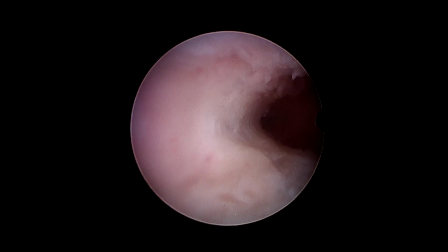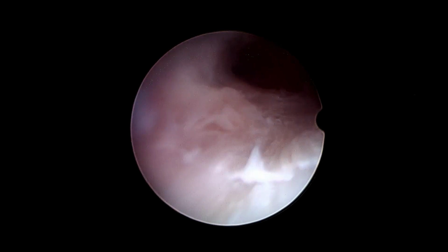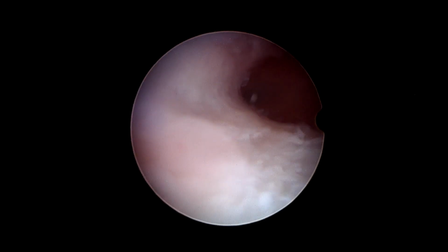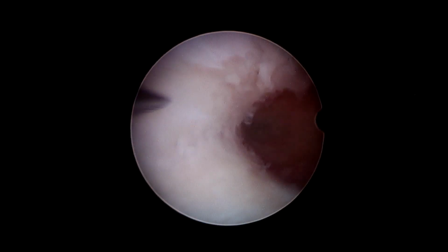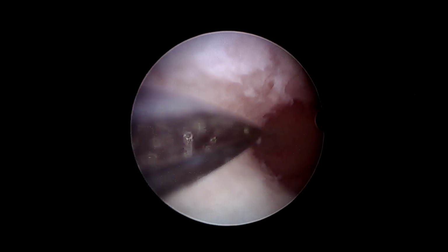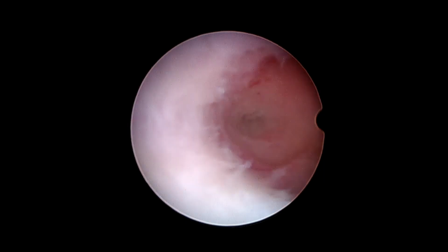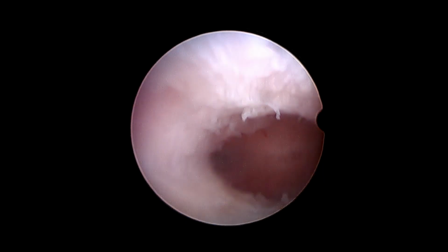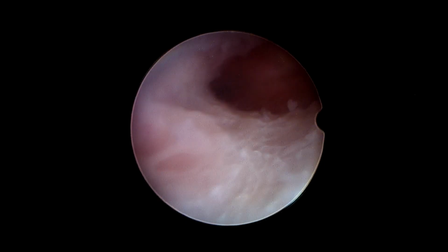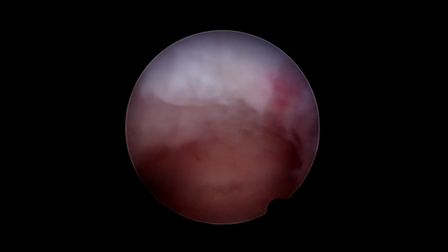This is the ostium of the right fallopian tube. Here also you can see a good amount of endometrium, and here you can notice the anterior and posterior wall is having this scar. This white colored tissue that you see is scar tissue, and we have to excise that to prevent further recurrence of intrauterine adhesions. For this precise reason, we use a bipolar resectoscope in this patient.